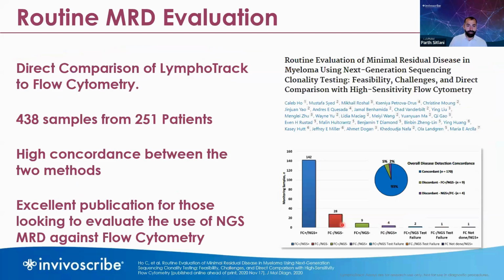So MRD evaluation is a more new concept, or not a new concept, but newly making it into the clinical space. This is, again, Memorial Sloan Kettering Cancer Center in New York City. This is a direct comparison of LymphoTrack to flow cytometry using 438 different time points from 251 patients. And what they found was there's a high concordance between the two methodologies.